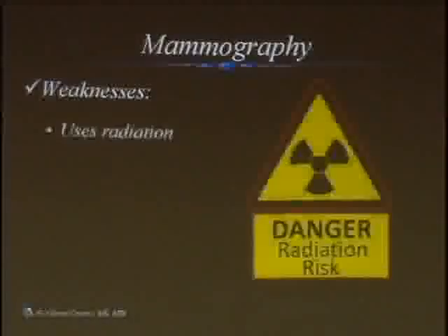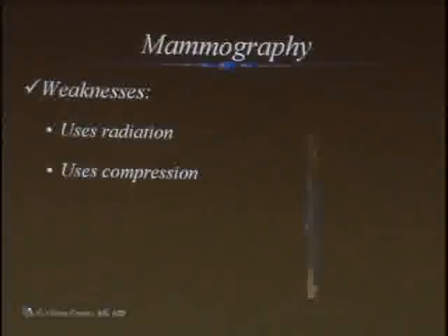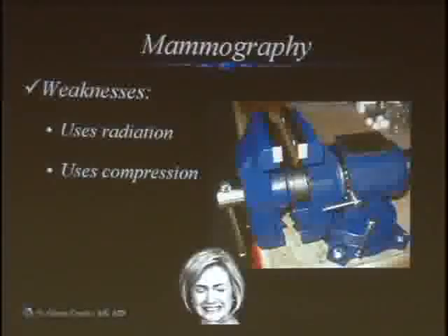What are the weaknesses of mammography? Number one, it uses radiation, and we're going to talk about the truth in radiation later, but I want you to understand it does use radiation. It also uses compression, and that's a bad thing. And every woman in here is shaking her head, and the men are just like, duh. Okay, women, you know what I'm talking about, right?